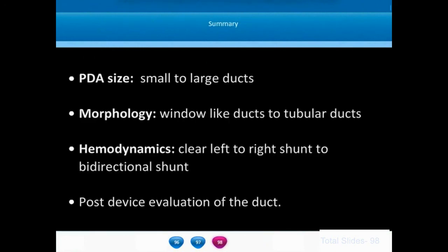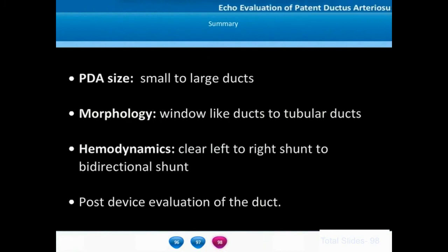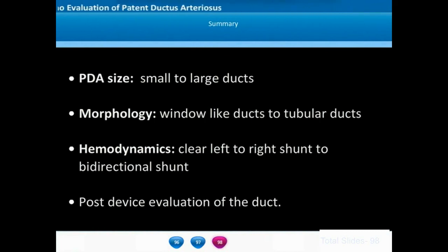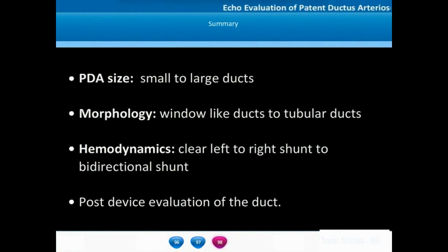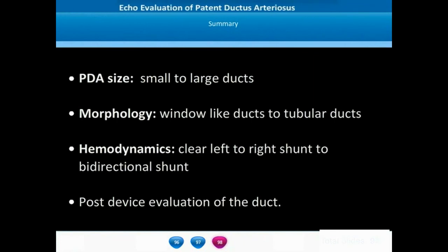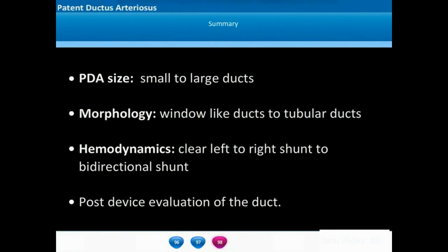A ductus arteriosus can be of different sizes — small, moderate, or large. The morphology may differ from a window-like ductus to a long tubular ductus. The hemodynamics may differ from a large left-right shunt to a bidirectional or entirely right-left shunt. In the post-interventional evaluation of a ductus arteriosus, we have to look at residual PDA flows, left pulmonary artery narrowing, and aortic arch narrowing.